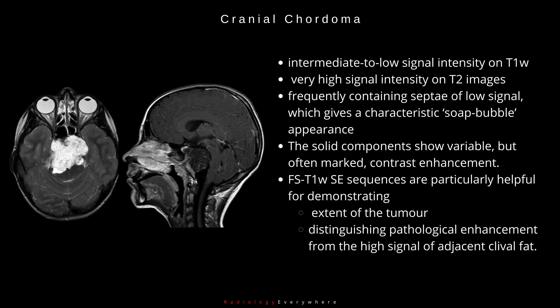MRI features include intermediate to low signal intensity on T1-weighted images and very high signal intensity on T2 images, frequently containing septae of low signal which gives a characteristic soap bubble appearance. The solid components show variable but often marked contrast enhancement. Fat-suppressed T1-weighted images are particularly helpful for demonstrating the extent of the tumor and distinguishing pathological enhancement from the high signal of adjacent clival fat.